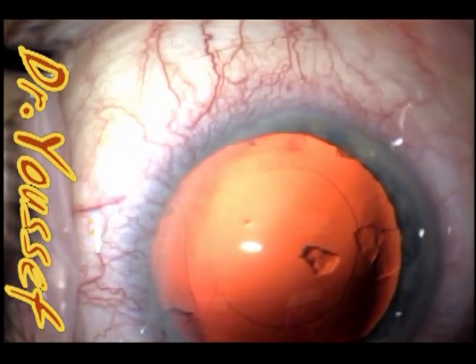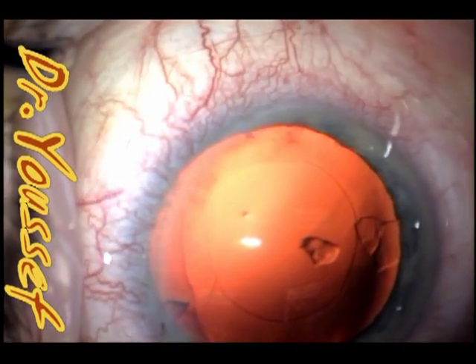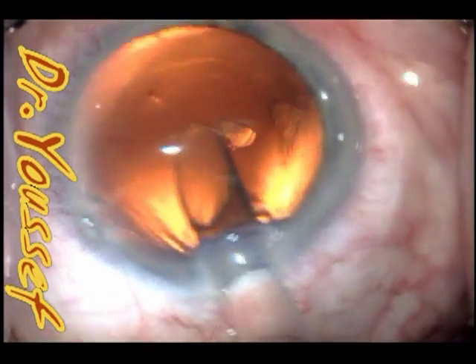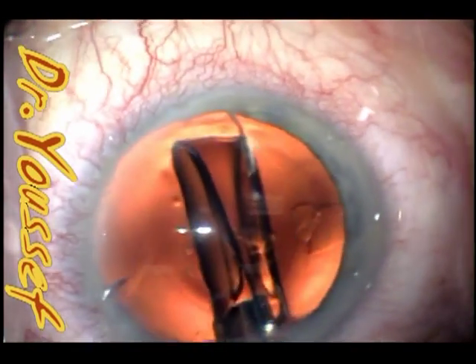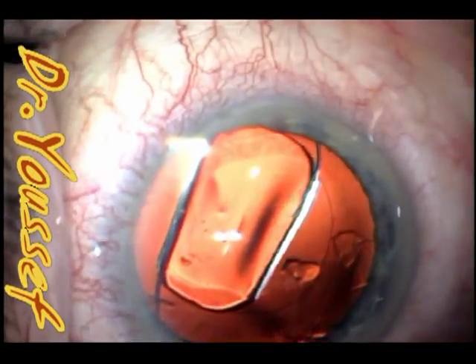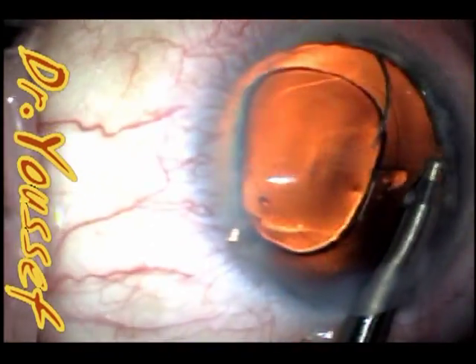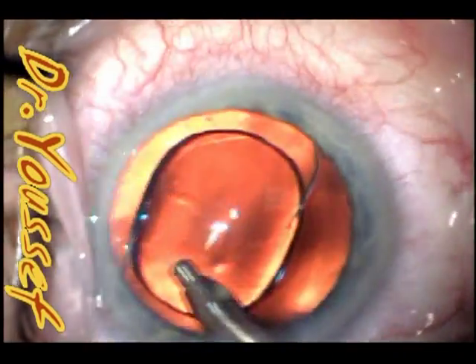The J cannula is done, healon is injected, and I'm going to implant the lens. My standard lens is the Tecnis ZA9003, the wavefront-guided acrylic lens from AMO. You can see some cortical material still there, but I don't address that until after I implant the lens and then do the irrigation aspiration — it's much safer that way.